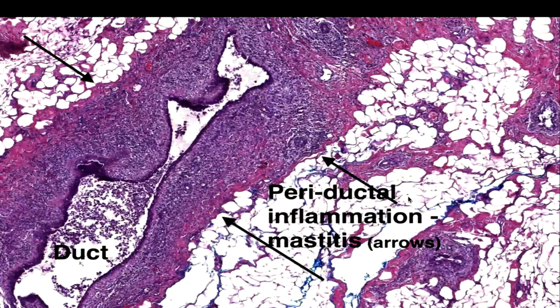So let me bring this back to pathology and why that is so. This is actually an inflamed cyst. This is that thick wall cyst on ultrasound. This is the cyst that enhances on its wall at MRI, but I didn't show it for that reason. What I showed is that this is all soft tissue density, because we got the duct filled with fluid, and then all the gray where there's fat is going to be of adipose density, here and here.